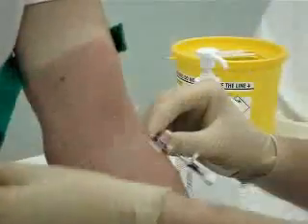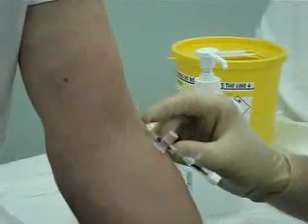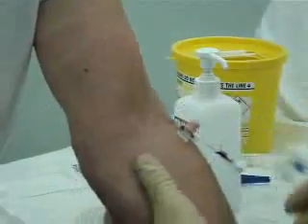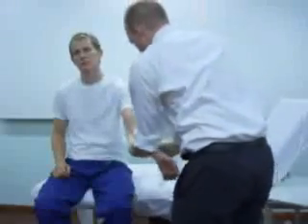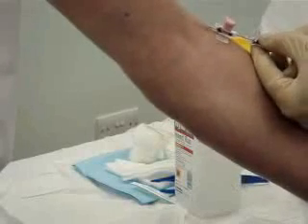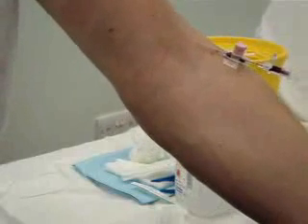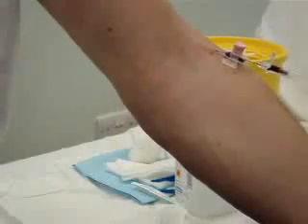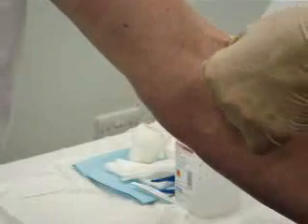At this point, you can take the tourniquet off. So what I'm going to ask Ben to do is just lift his arm up now for the sake of gravity and just for demonstrating. I'm just going to now remove the cap from the end of this cannula. Okay, pop that just to one side for a second. Sometimes it's helpful just to put a small bit of gauze down just to help prevent any flowback of blood just in this area.